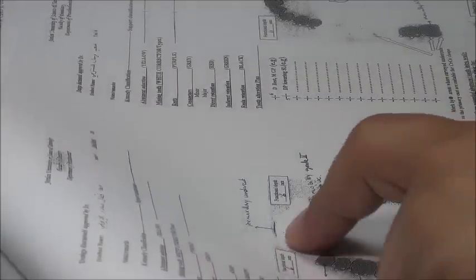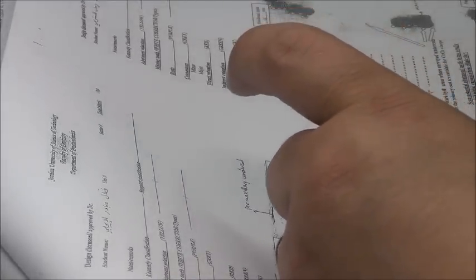But I have a condition when I want to do this. All of my guide planes, I prepare them in the new orientation, not the old one. I don't do vertical guide planes on the teeth. I tilt all of the guide planes in the path of insertion direction. Another option, no undercuts. For example, why not use a premaxillary undercut? And this is also tilting the guide plane preparations in a new path of insertion. I tilt the cast posteriorly on the survey machine or the survey table. So it's a posterior tilt.